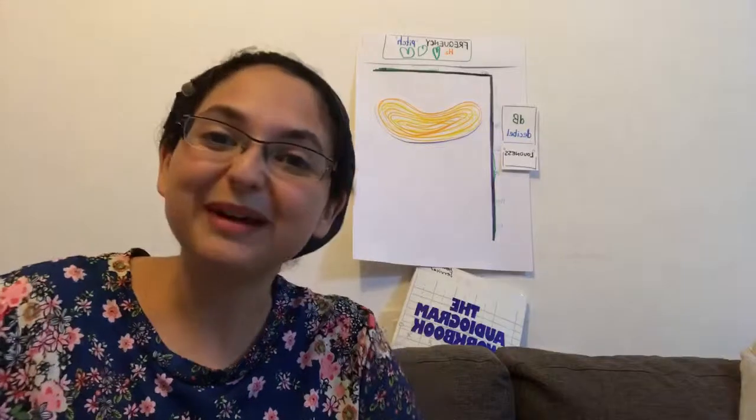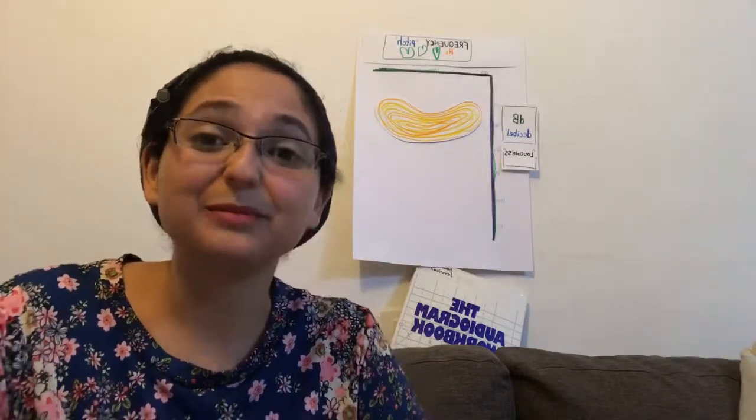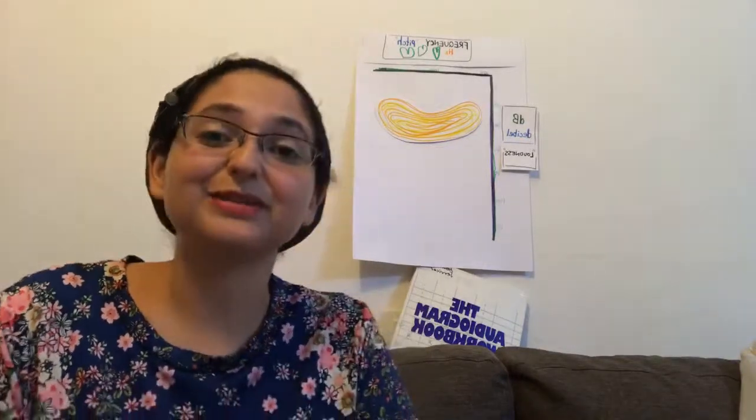So we've talked about the audiogram and why it's important to know how to read it. This was a very quick overview, and I hope it was helpful to you. But if you have any more questions, feel free to leave them in the comments.